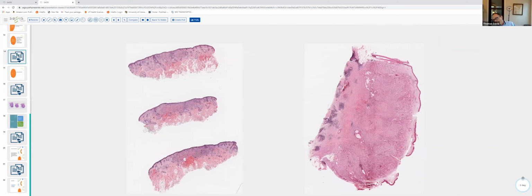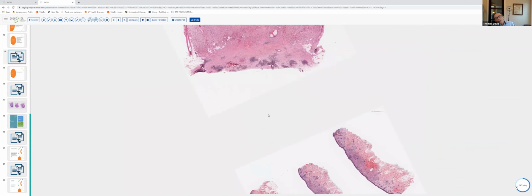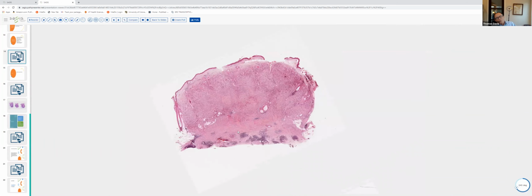Now let's go ahead and move on to our next slide. This is absolutely a huge piece of tissue.